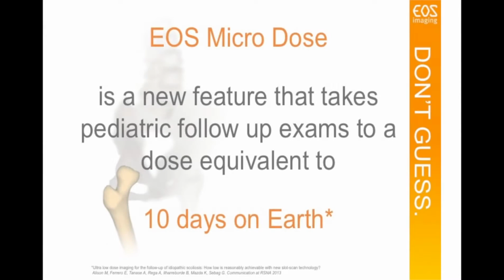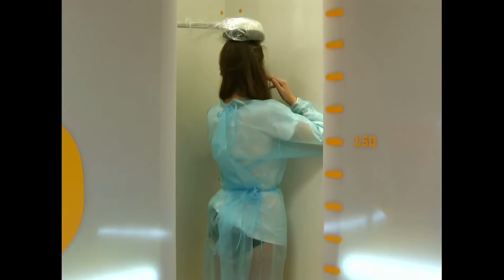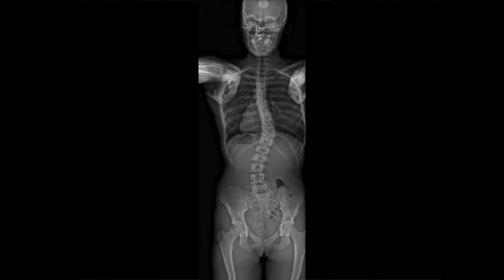What we have achieved recently and we have published show that we can diminish the dose, achieving the microdose, by a factor of 6. The optimization of microdose was set up especially for scoliosis in the adolescent population, so it's really high. And the population is at risk, especially in adolescents, because you have the growth spurt, and so the curvature can double or triple. So you have to have a very good monitoring at this period.